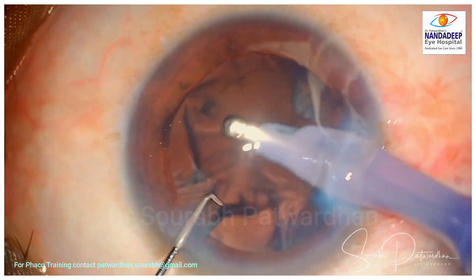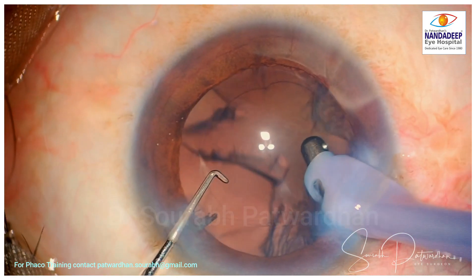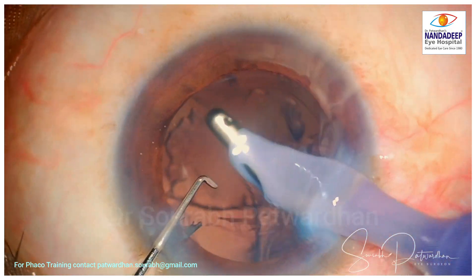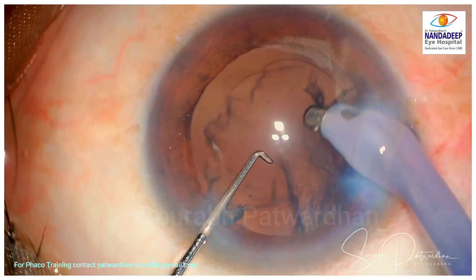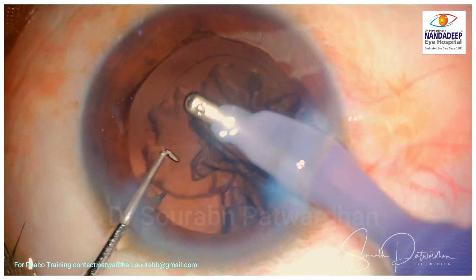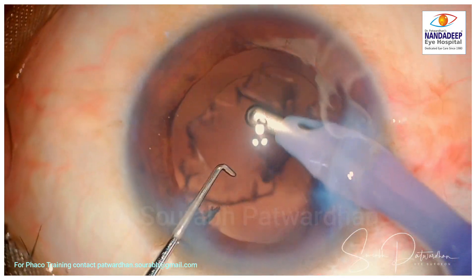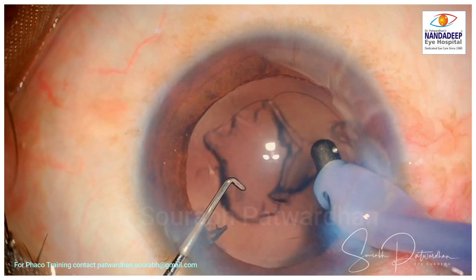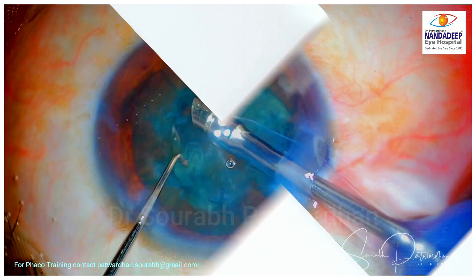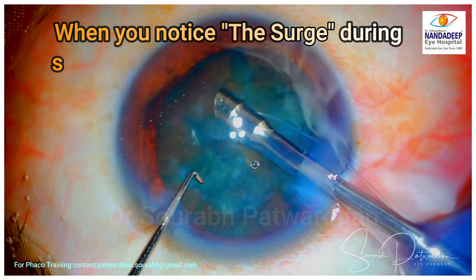Of course, if there are still fluctuations, I might resort to making a new incision and completing the surgery. Once I shift to the 2.8 mm sleeve, the anterior chamber is well stable with the previous parameters as well.